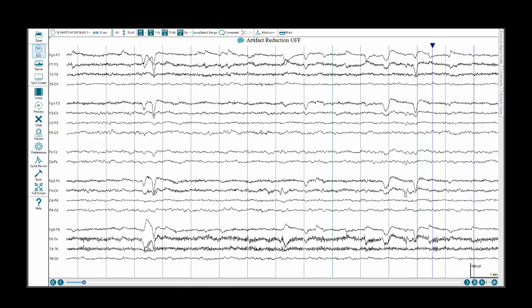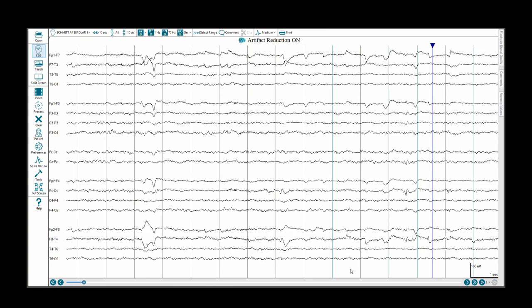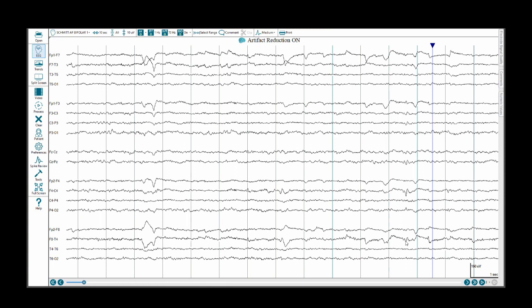C4 is more involved, or closer to the originating signal, or closer to the maximum of this particular discharge. So it is going to be more negative with respect to F4, since it is in input 2 there is a downward deflection. It could be the case that C4 and P4 are equally complicit, therefore there is no deflection. P4 as compared to O2, there is an upward deflection, P4 is more negative. You can also see there is a downward deflection in the F8 T4 channel because T4 is complicit or within the zone of electrodes affected by this discharge.